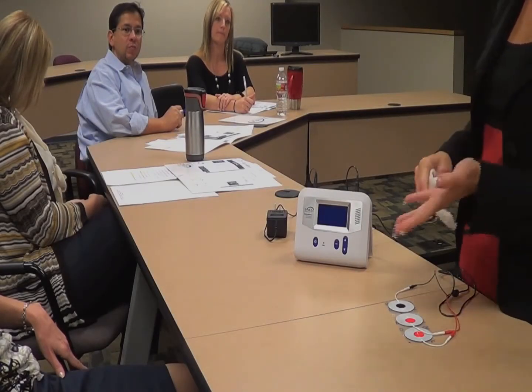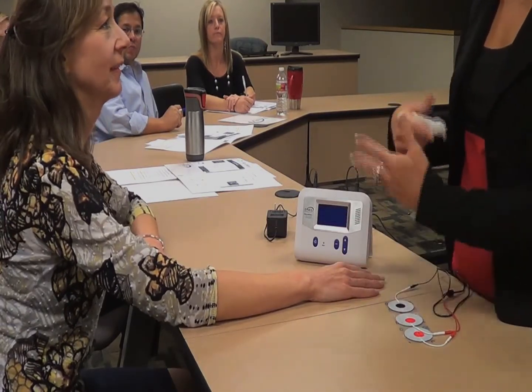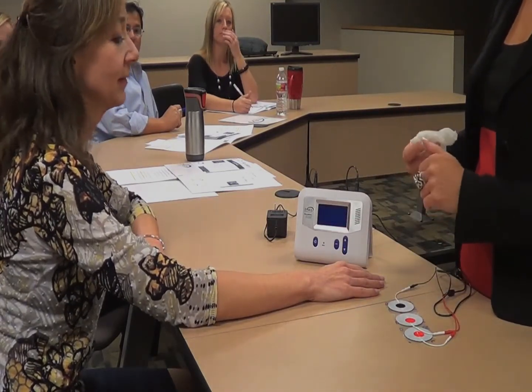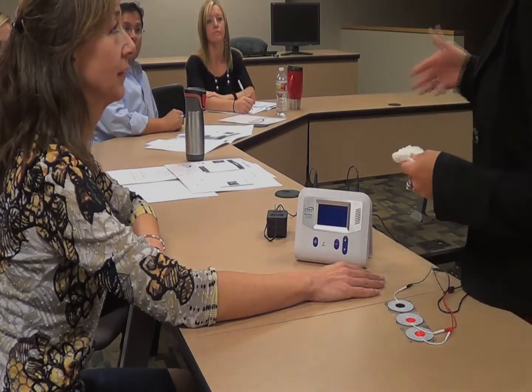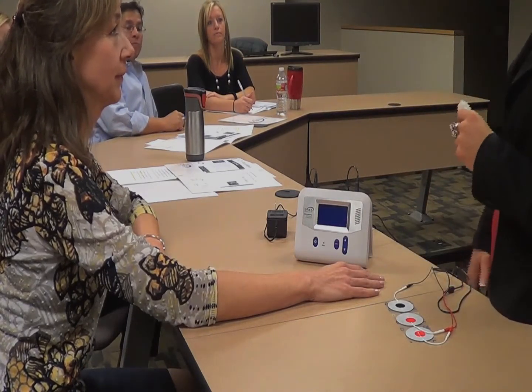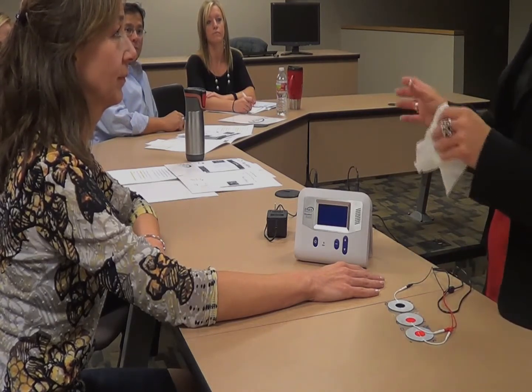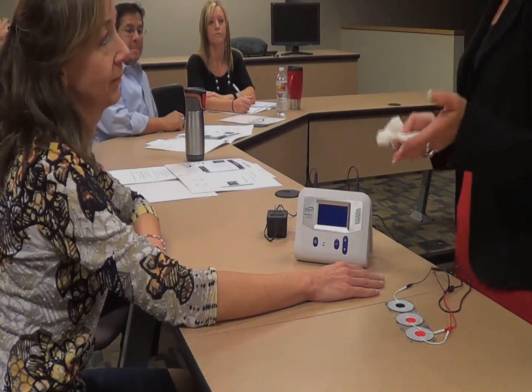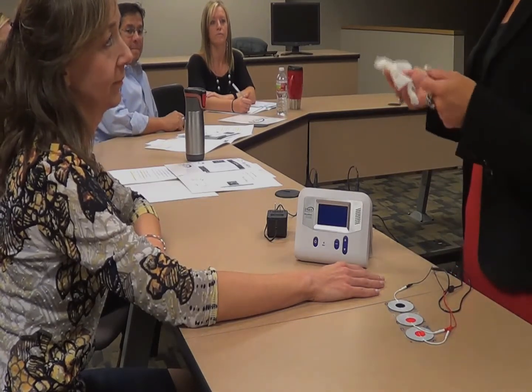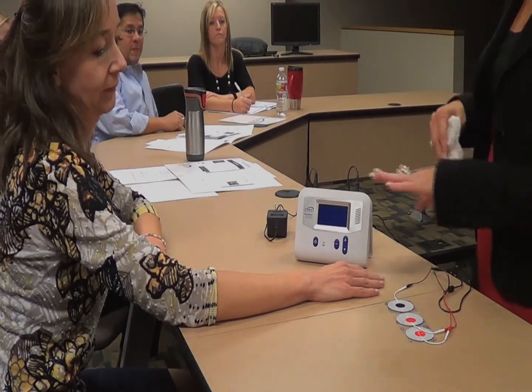Okay, so why don't you go ahead. What we'll do is, after I put the electrodes on you, I'll just have you relax in your lap. Or maybe we'll leave it on the table. Typically, when you're dealing with a patient, you would just have them relax in their lap. That's the most natural way. So we'll do it this way, and I'm going to turn this at some point so you can see it as well. But for training purposes, we want our other reps and people to be able to see what the difference is on the screen too.